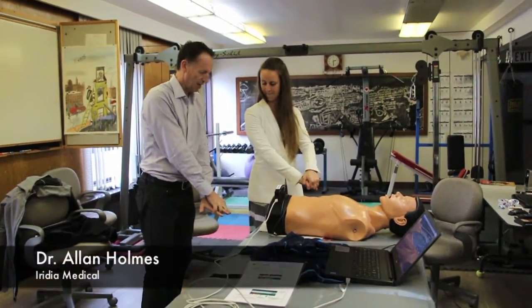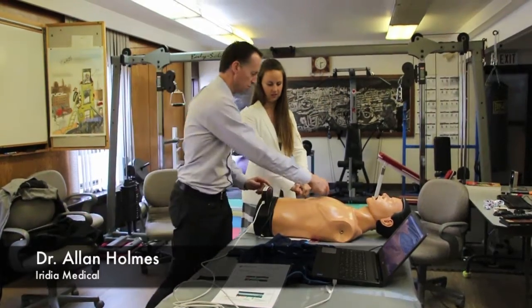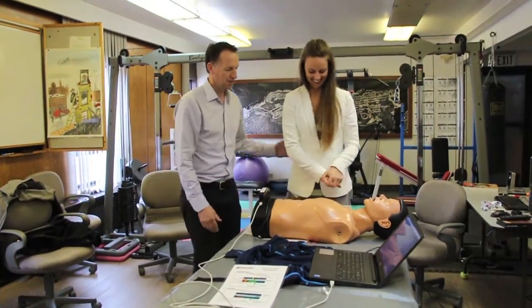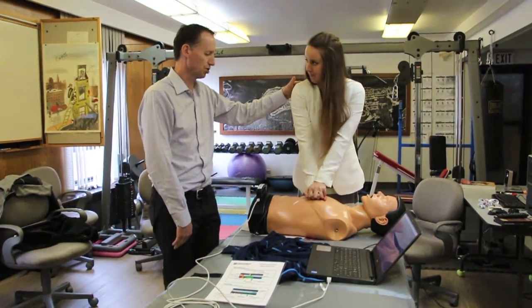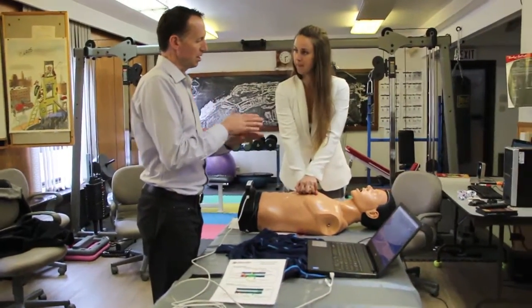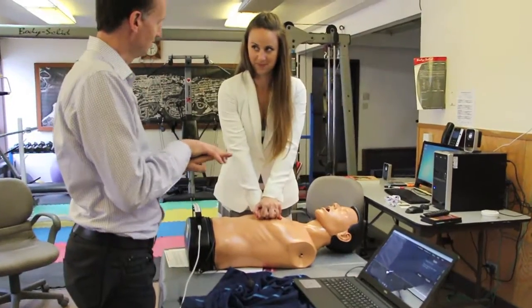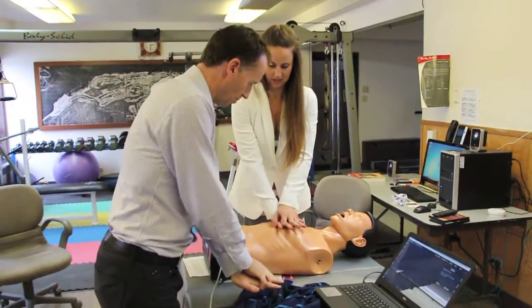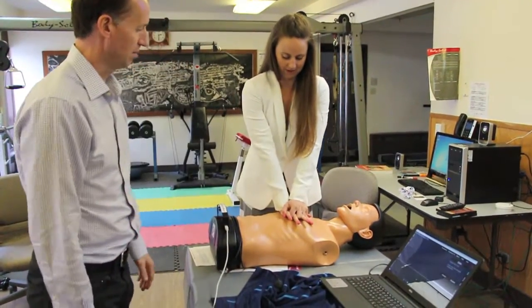Okay, like that — go right over the top and push straight down over the center of the chest. From this angle, come from over here, get your shoulders a little further forward so that you're pushing straight down. Think 'Staying Alive' in your brain — the old Bee Gees song. Elbows locked, pushing straight down.